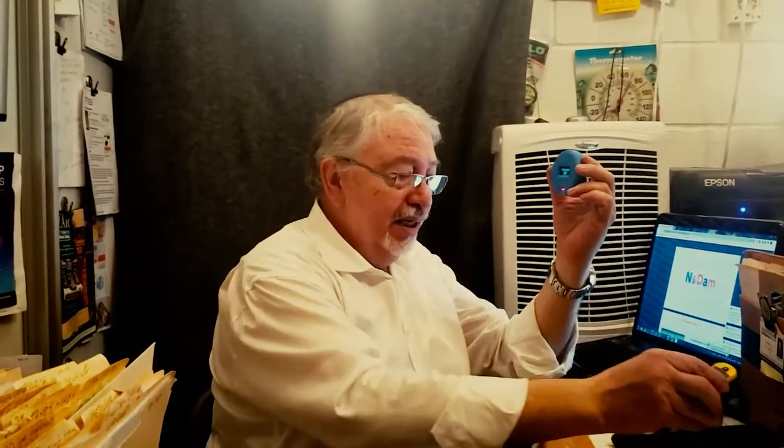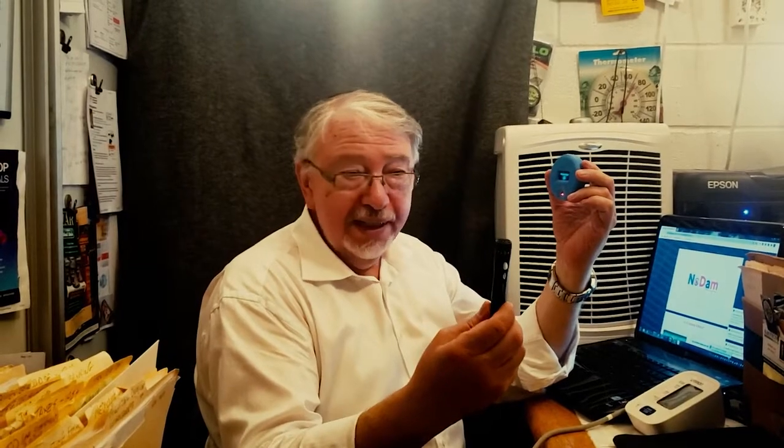This Nodam Glucose Monitor replaces the blood pressure monitor, replaces the pulse oximeter, which checks my blood saturation level as well as my pulse, and it replaces my glucose monitor, which involves a monthly expense of lancets as well as test strips. Of course, it works by piercing the finger, drawing a drop of blood, and testing that.